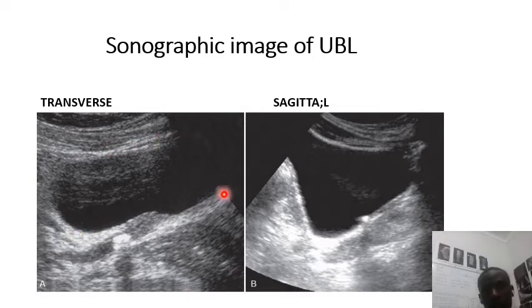rectangular structure. So you measure the wall thickness, and after that you may also measure the volume of the collected urine. If the next volume, then still it is on the sagittal image. You take two measurement points, that is the length, then the width or the AP, then finally you take a transverse diameter. Okay, so that's all what we can see on the urinary bladder.